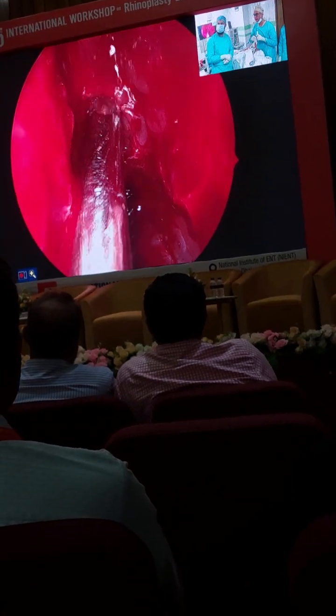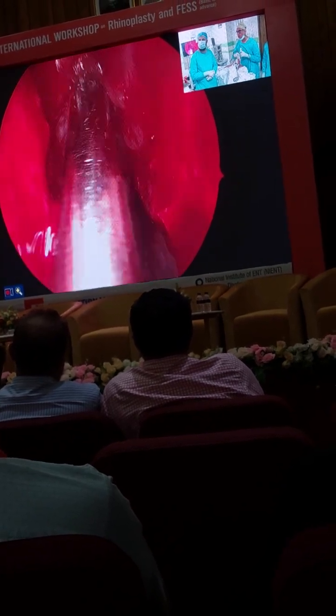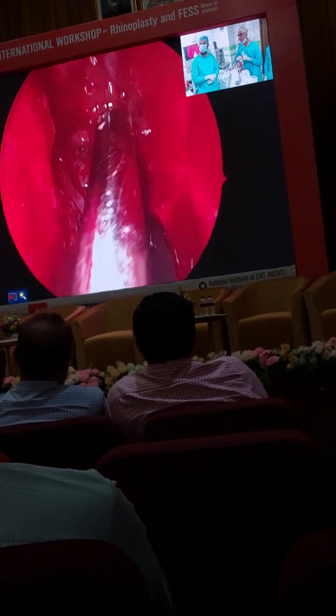Also in the morning, I remember I told you when there's bleeding, one of the things you can do is open spaces. So that's what we are doing, allowing the blood to now trickle back. And now you can see I'm getting to the skull base. Exactly.